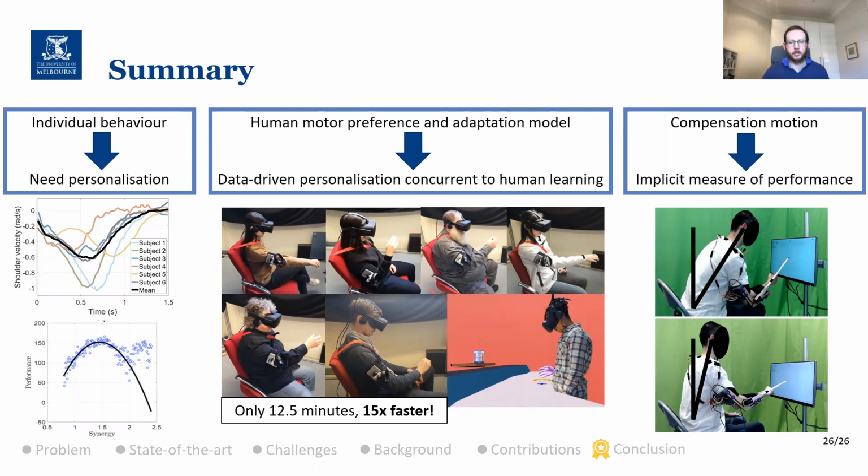Right. So it is really limited by the information that you can get from the IMU sensors, I suppose.